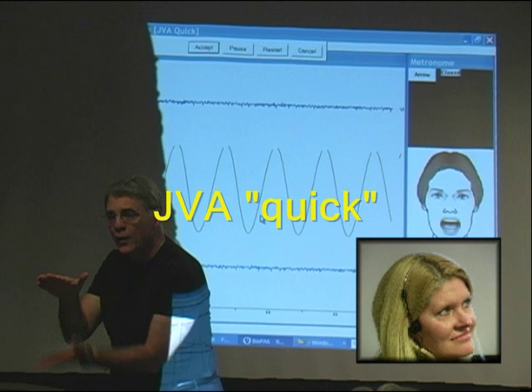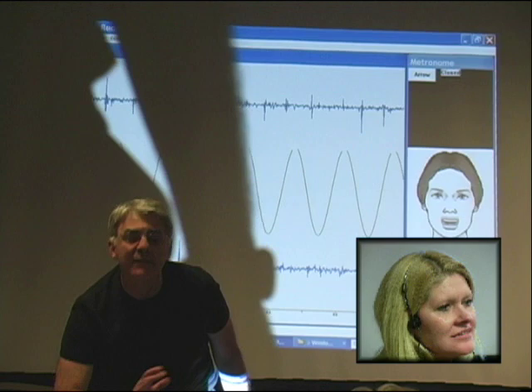Open, close, open, tap, open, tap, wide, tap, wide, tap, stop.